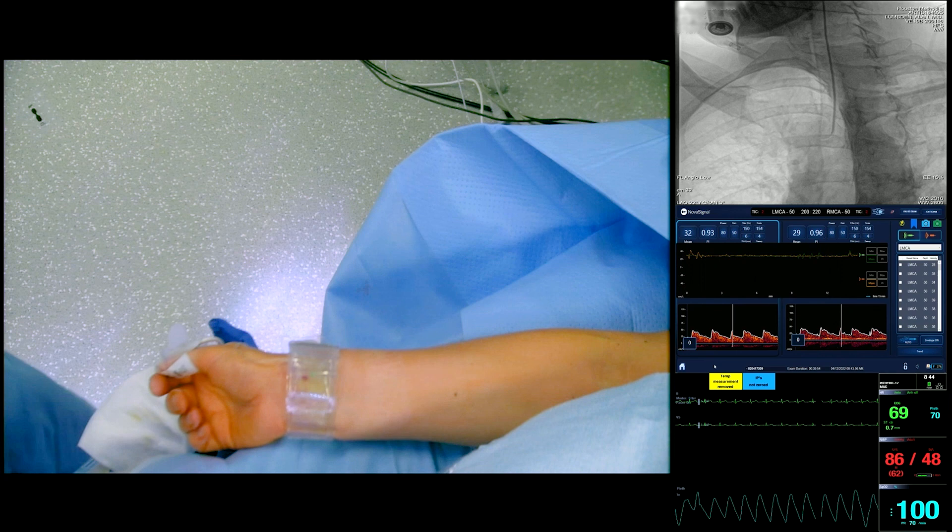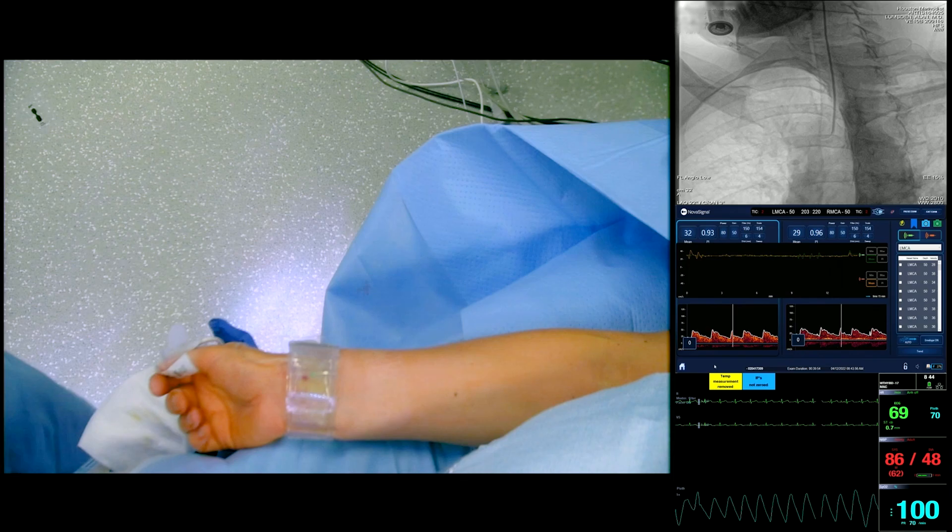So that's a very straightforward demonstration of doing a four-vessel cerebral angiogram via a right transradial approach.